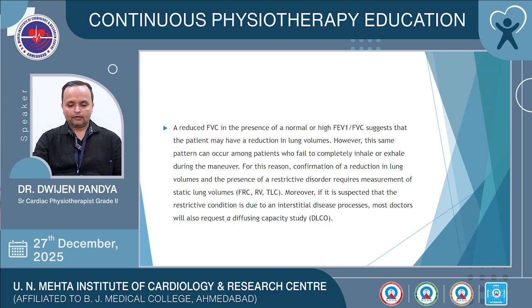A reduced FVC in the presence of a normal or high FEV1/FVC ratio suggests that the patient may have a reduction in lung volumes. However, this pattern can occur among patients who fail to completely inhale or exhale during the maneuver.